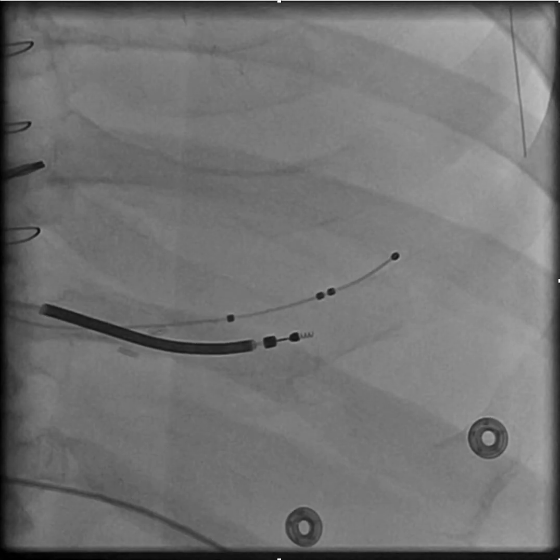Same person doing the case, this time using a different system — and it's not uncommon to see this sort of struggle when you don't have adequate tools.